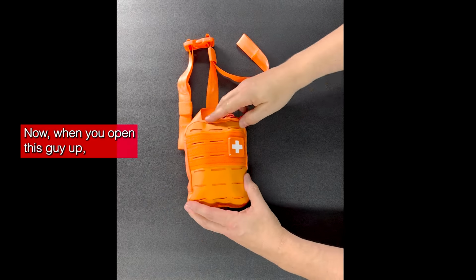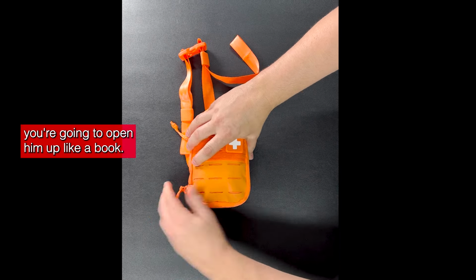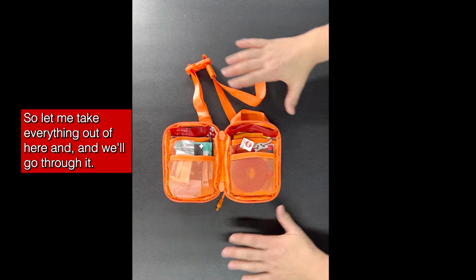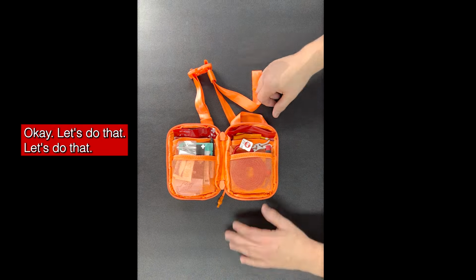Now when you open this guy up, you're going to open him up like a book, all right? And you're going to see that everything is easy to find. There's multiple pockets on each side. So let me take everything out of here, and we'll go through it, okay? Let's do that.